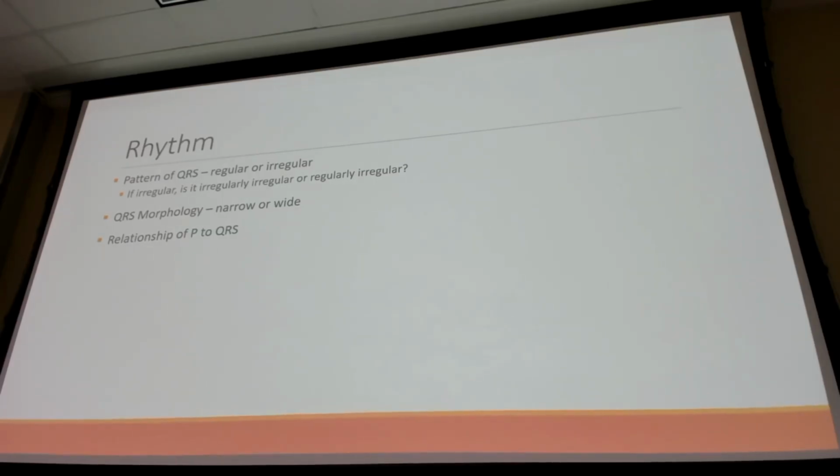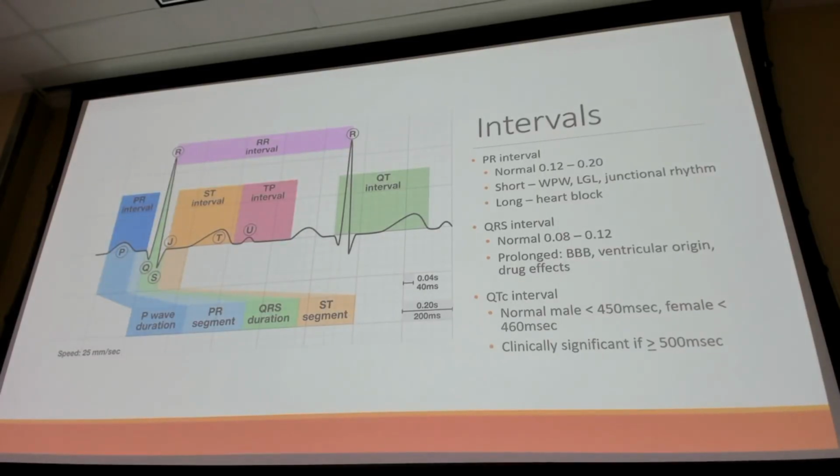I guess it's torsades, really just like a ventricular tachycardia, because that could be a life-threatening arrhythmia. So then we want to look at whether it's regular, we have boxes we put them in. If it's irregular, we have boxes we put them in. And we won't go over that because we're focusing on really the approach to chest pain, acute coronary syndrome in this lecture.